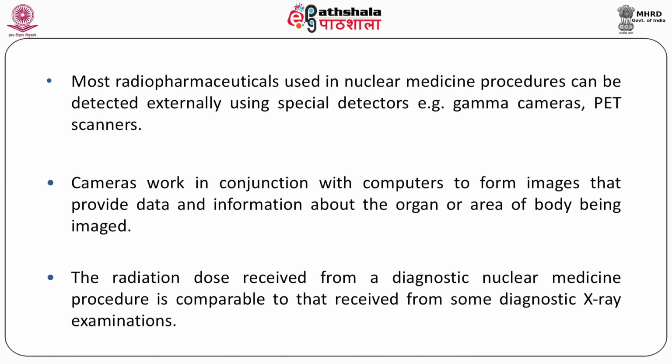I keep emphasizing those important things. One is the radiopharmaceutical and the other is the devices. If the device is good and the radiopharmaceutical is good, you can diagnose the disease at a very early stage. Cameras work in conjunction with computers to form images that provide data and information about the organ or area of the body being imaged, and finally based on this only, doctors can make a regime to treat the disease.